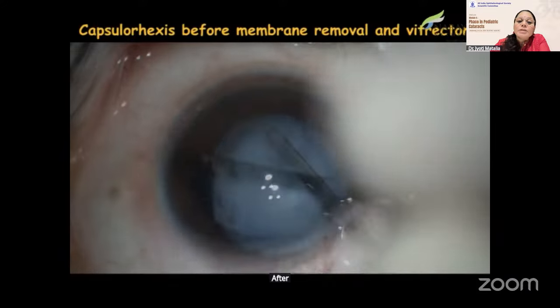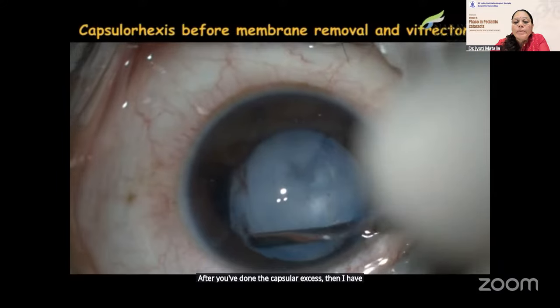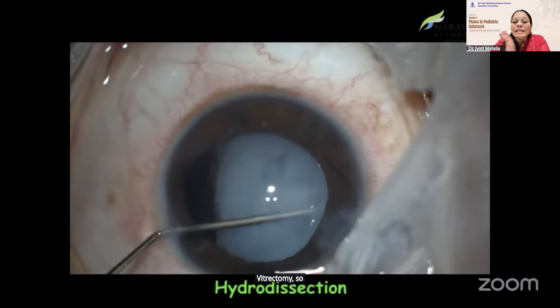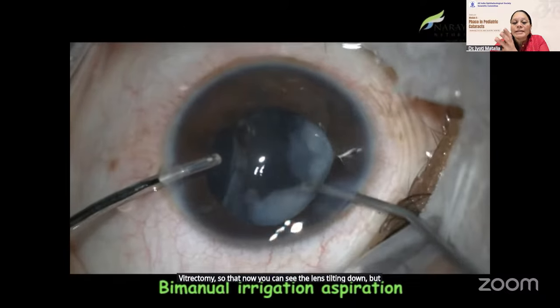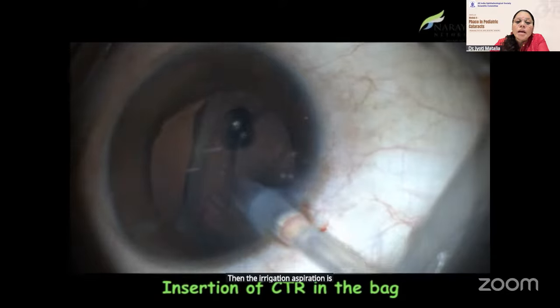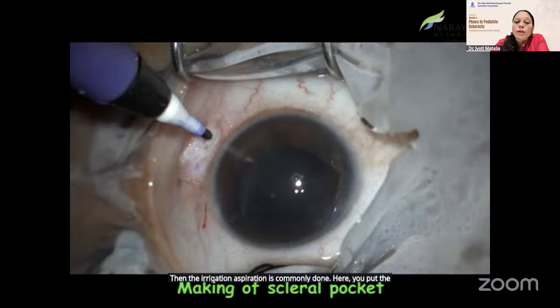After you've done the capsular rhexis, then I have tried to remove the membrane over it and done a good vitrectomy, so that now you can see the lens tilting down. But we are not worried because the rhexis has already been done. Then the irrigation aspiration is commonly done. Here you put the CTR in the bag to inflate it.